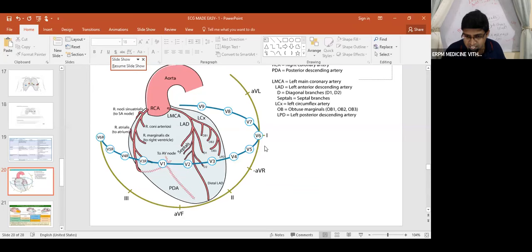AVR, AVL, AVF. What is left now? Lead 1, 2, 3. Am I right? Come on, look at me. Look here. If you look at the AVL, this is your AVL. This is your lead 1.